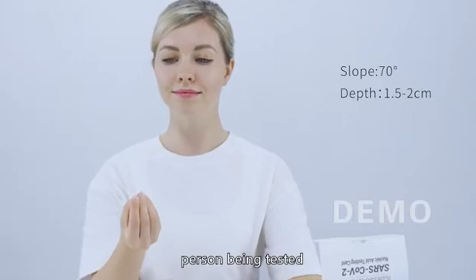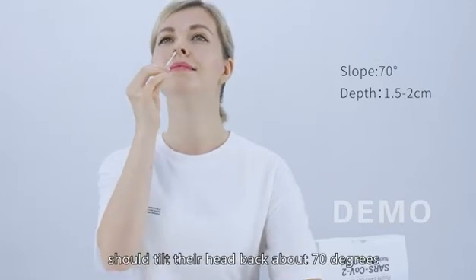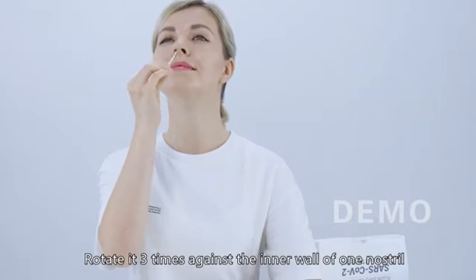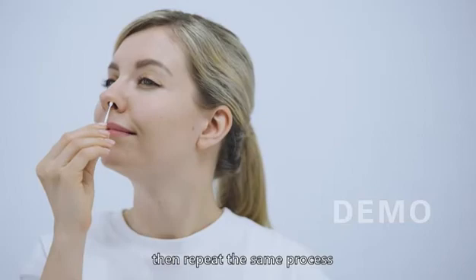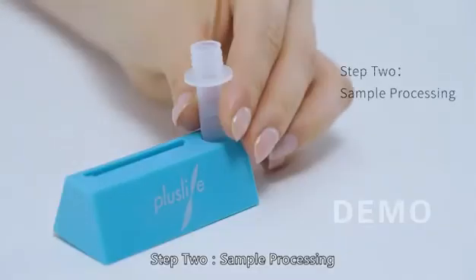During sampling, the person being tested should tilt their head back about 70 degrees. Insert the swab tip into one nostril until it meets resistance, then rotate it 3 times against the inner wall. Repeat the same process for the other nostril to finish sampling.